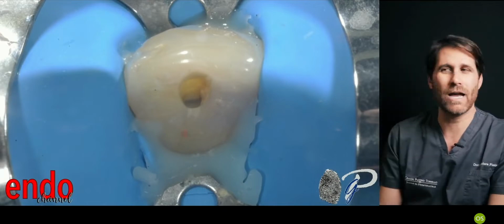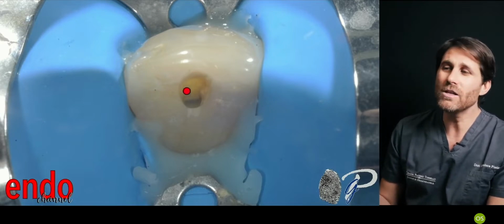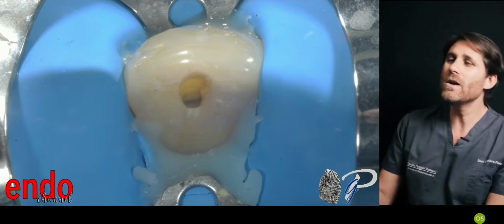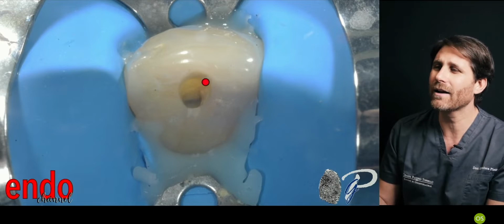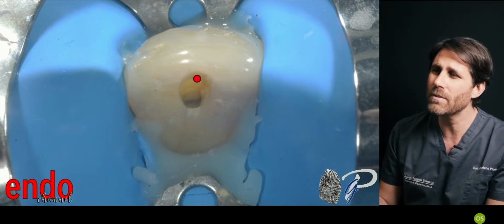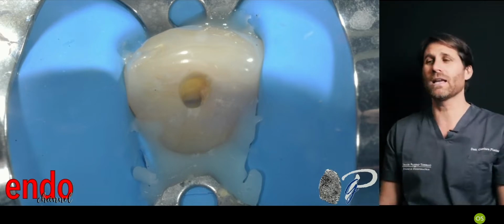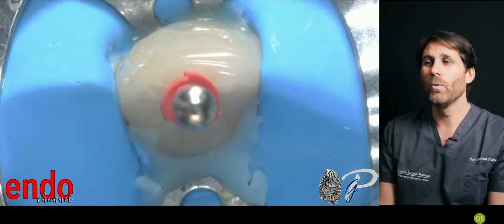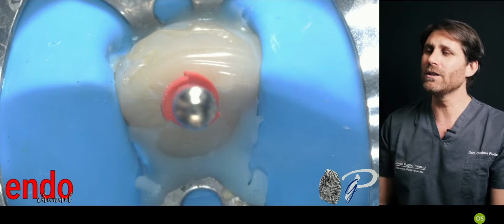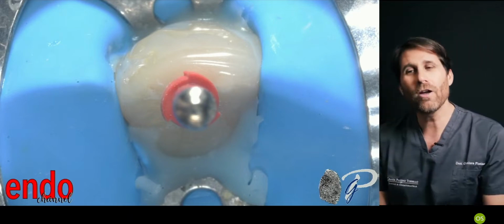This is not a ninja access cavity. This is a conservative cavity because it's not traditional, because we moved this conservative cavity more incisally. So we don't need anymore to perform a triangular cavity to include the pulp horns, because we can include the pulp horns going from mesial from one side and from distal from the other side of this cavity. And the instrument will go inside the canal with a straight line direction. It is straight inside the root canal without any interference.